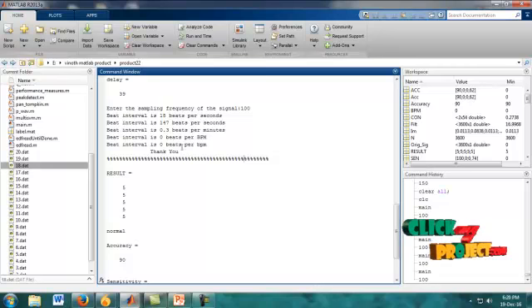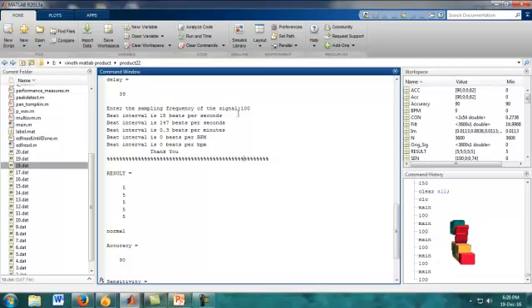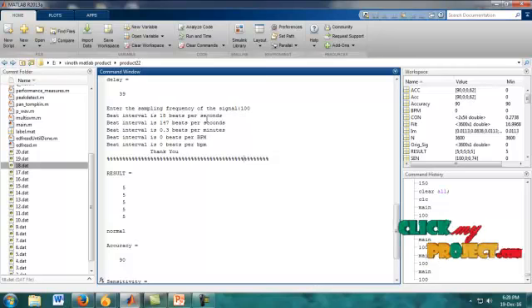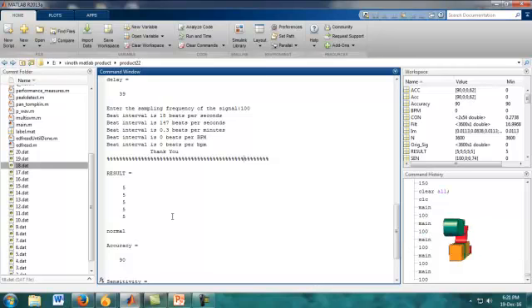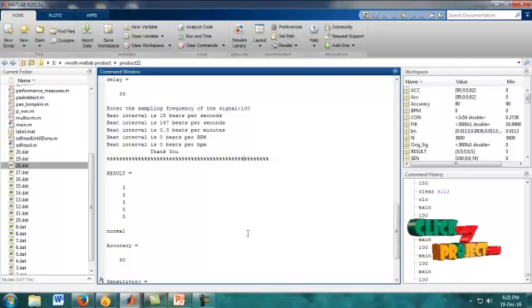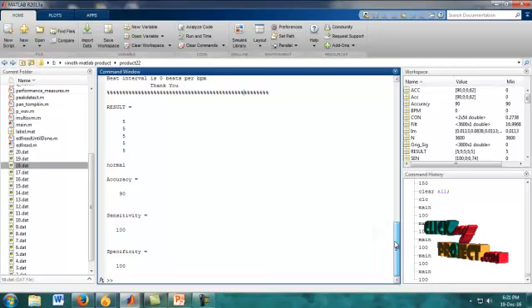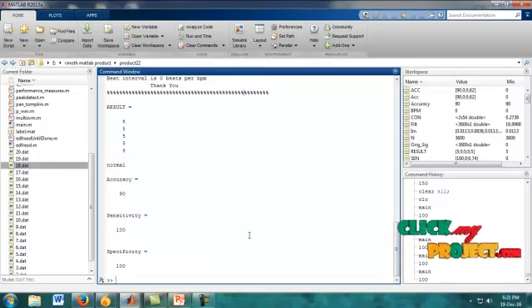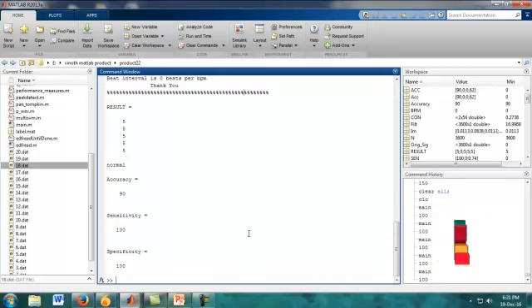In the command window, the sampling frequency and maximum beat rate level are shown. Results also show whether signals are normal or abnormal, which is also shown in the workspace. Accuracy, sensitivity, and specificity values are also shown in the command window. The project demo is now completed.